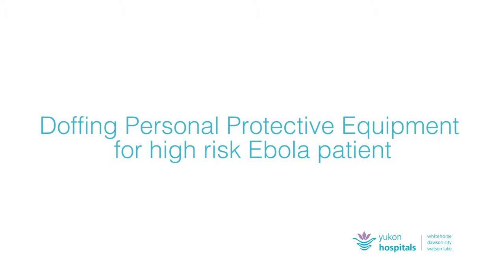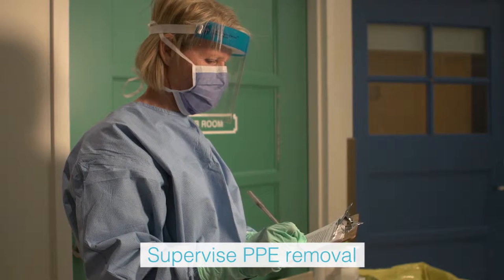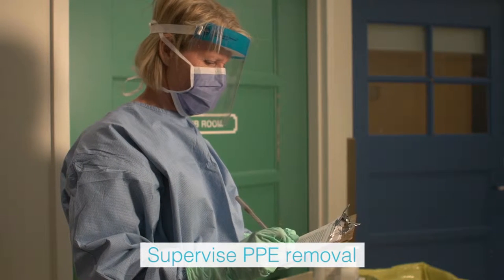This video demonstrates the proper procedure for doffing personal protective equipment for a high risk Ebola patient, used for both the trained observer and the health care provider. The trained observer is available to supervise the doffing procedure and is wearing appropriate PPE.